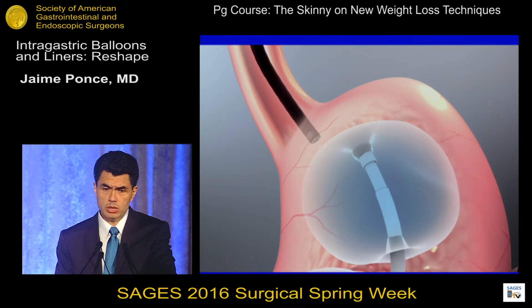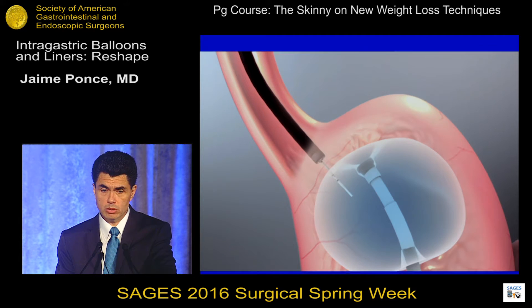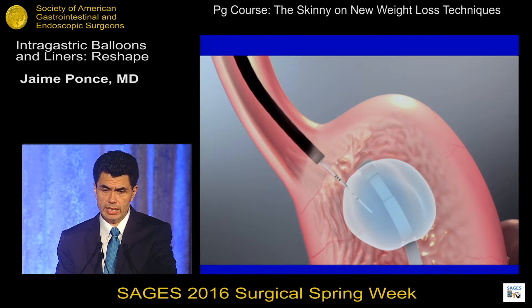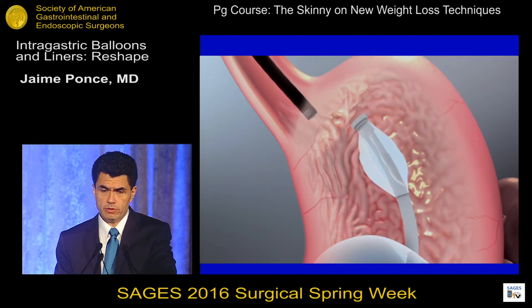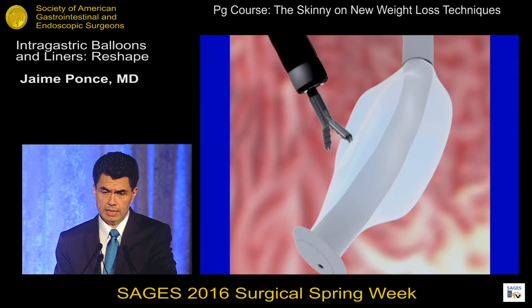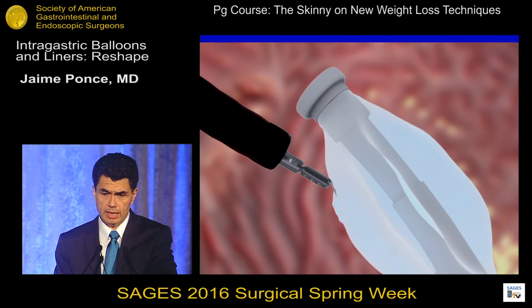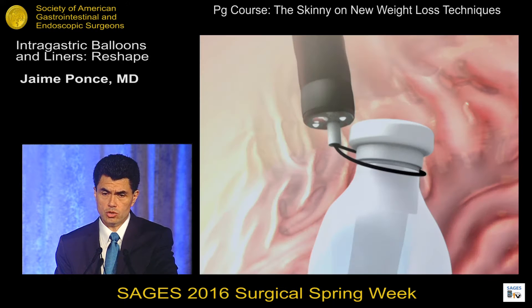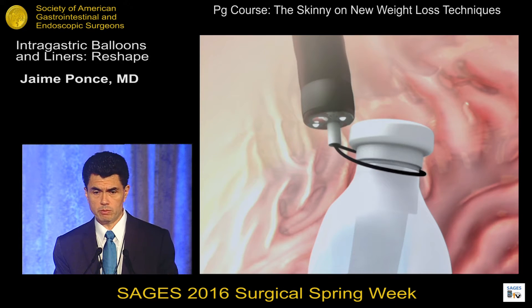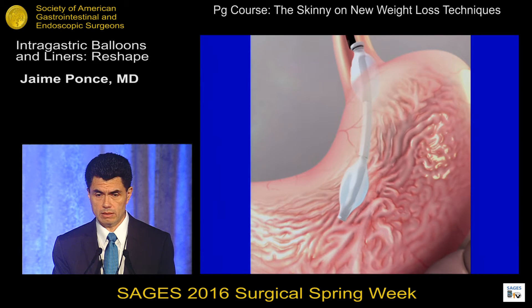The removal procedure is also done endoscopically. We go in with a suction catheter and puncture each balloon, aspirating each one completely. After aspiration, we use a rat tooth grasper to take a bite on each balloon to ventilate whatever air gets trapped. Then we use a snare to lasso the proximal tip of the balloon and remove it. The snare is safe because as long as you have it around the tip, it will not become detached.